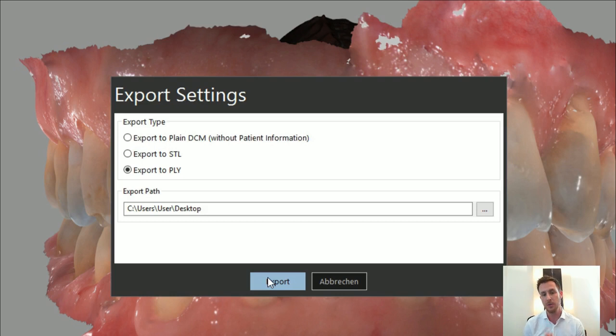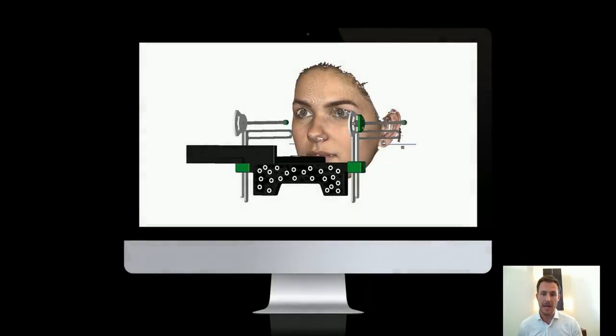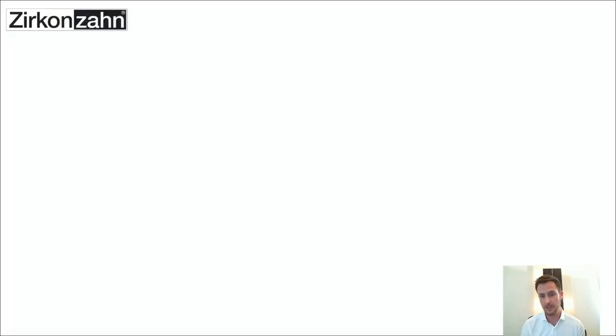I really say it again, whoever is working with this kind of workflow, please scan the whole palate area of the maxilla and the tuber region. That has mounting-related or measurement-related functions. So if that is done, then we go over to the registration process of the patient itself.